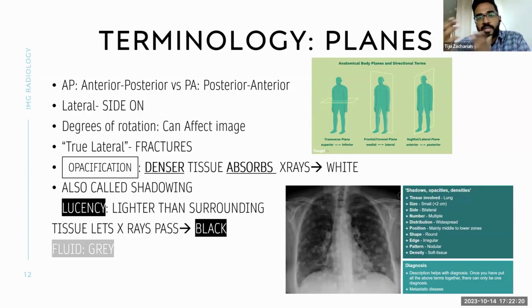So the ones that reach will appear as black, and the ones that don't reach appear as white. That is in the simplest terms. We will come into it in a bit more detail.